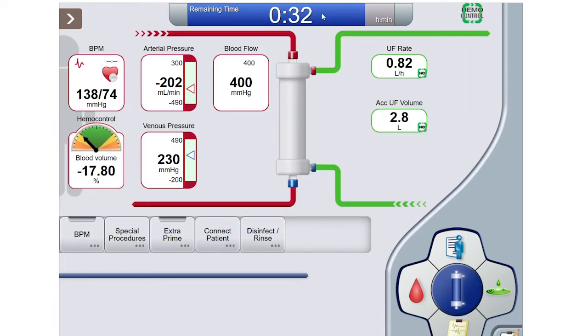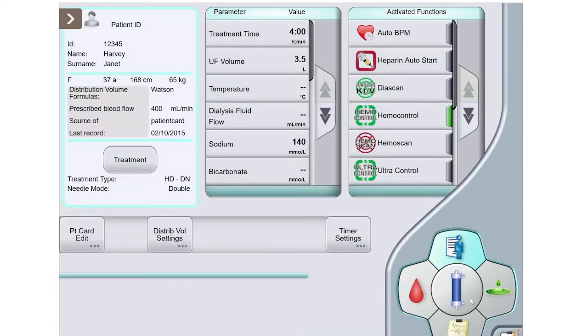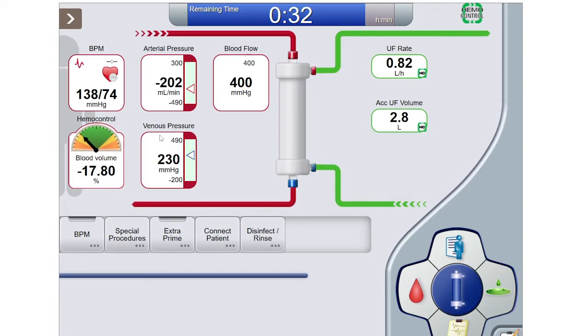One thing that I would like to note, of course, is that this is just a simulation, and I don't feel it's an excellent representation of a real-world scenario for a number of reasons. Normally, and again, this is just my 2 cents, rather than only making adjustments when the blue reminders pop, which is what this simulator allows you to do, with no room for making adjustments in between, I suggest doing your Q30-minute checks, critically evaluating your patient's condition and the HemoControl forecast values, and making minor adjustments as the run proceeds. That way you're not playing catch-up. So I think this is a good example of playing catch-up.